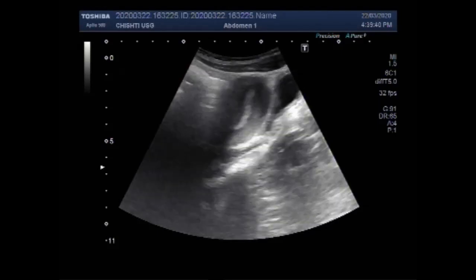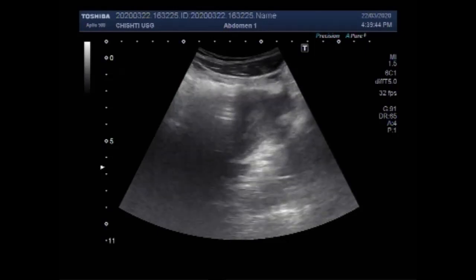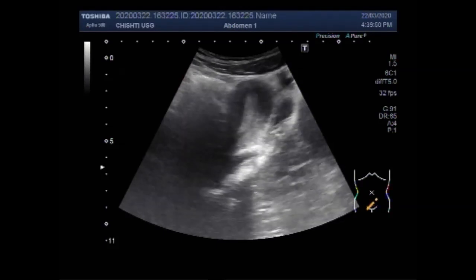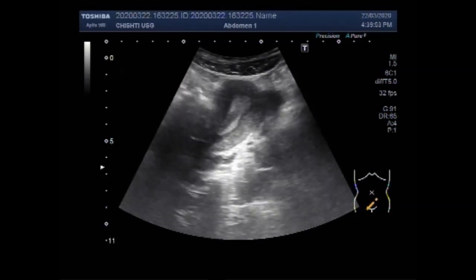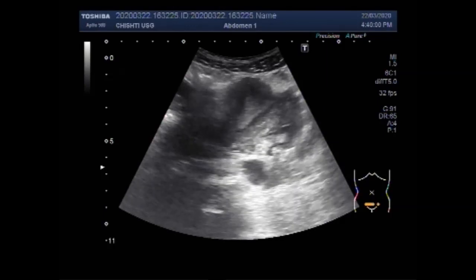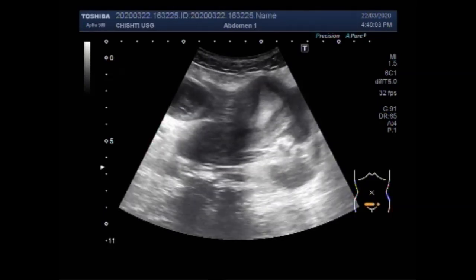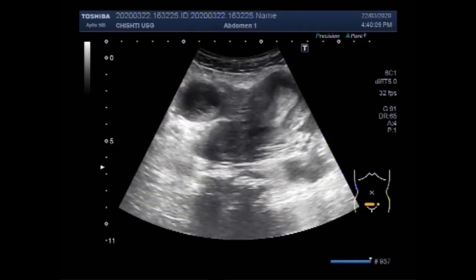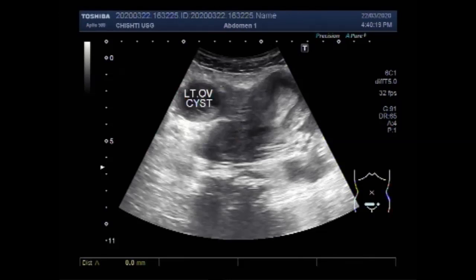A female patient — a young woman — was presenting with right iliac fossa pain. Acute gynecological disease processes such as ovarian torsion, hemorrhagic ovarian cyst, pelvic inflammatory disease, and ectopic pregnancy should be considered within the differential diagnosis. You can see this is the left ovarian cyst, which measures about 3.3 cm x 3.1 cm.